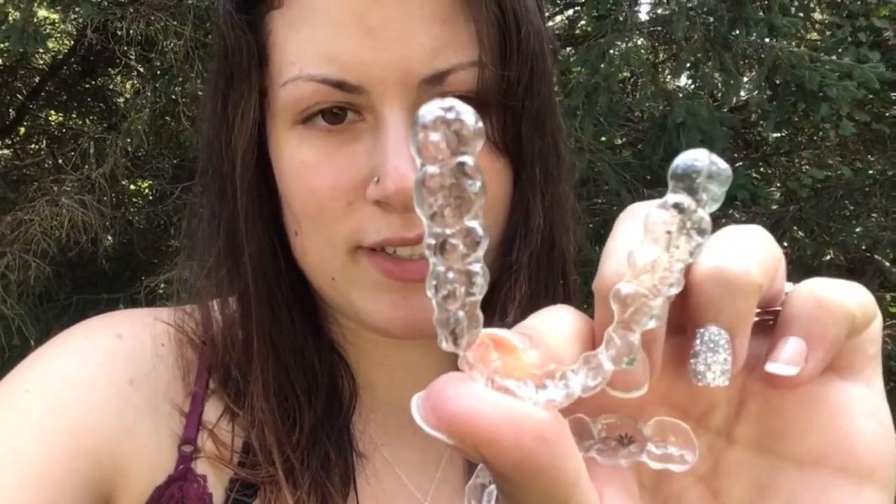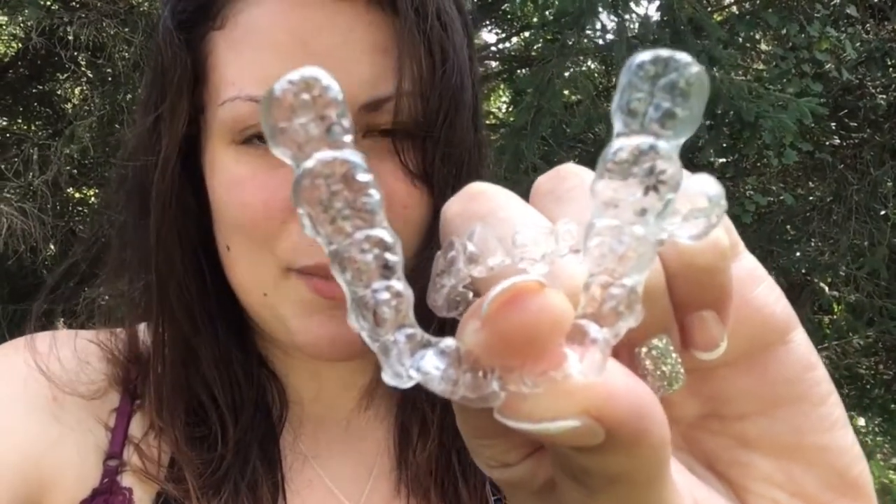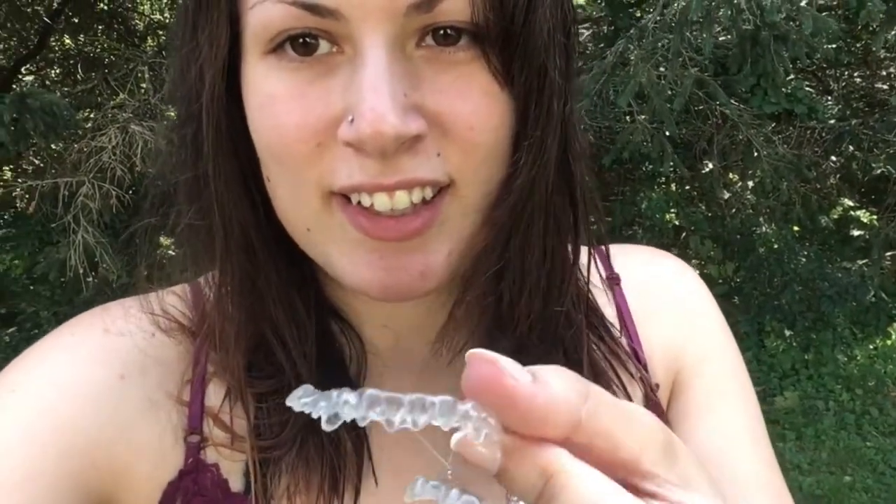I don't know if you can see — I'm trying to do this all one-handed, sorry. This is tray one and this is tray two. You can kind of see the logo there; some of it kind of came off because I ground it off. My teeth — it literally fits the shape of my teeth. I did cut my Invisalign though.